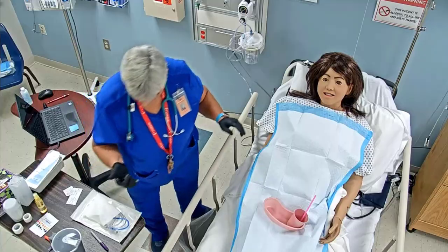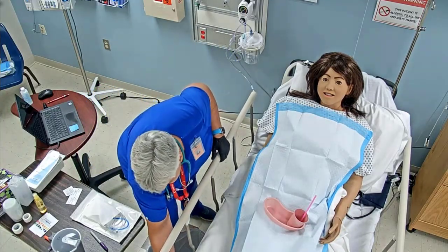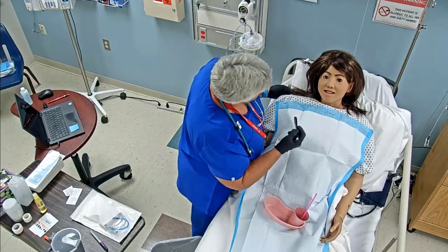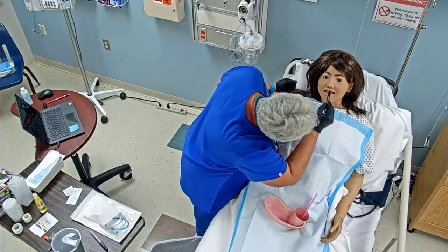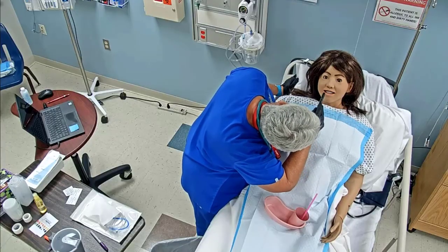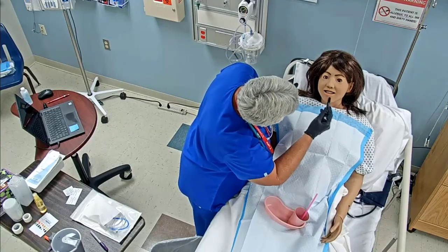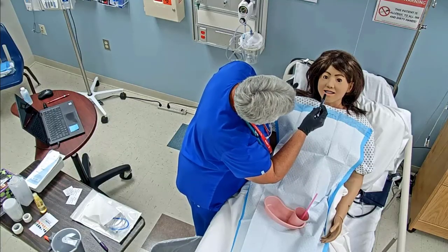Okay, so before we go any further though, I'm going to go ahead and put this side rail down. And I've got it to a good working height. Alright, and what I'm going to do is look in your nose, and also looking at skin integrity. I'm going to look at your nose to see which one is more open. So they both look open. Do you have a preference, that you have problem breathing out of one or the other one? No? Okay, so we're going to go in this right side here, okay?